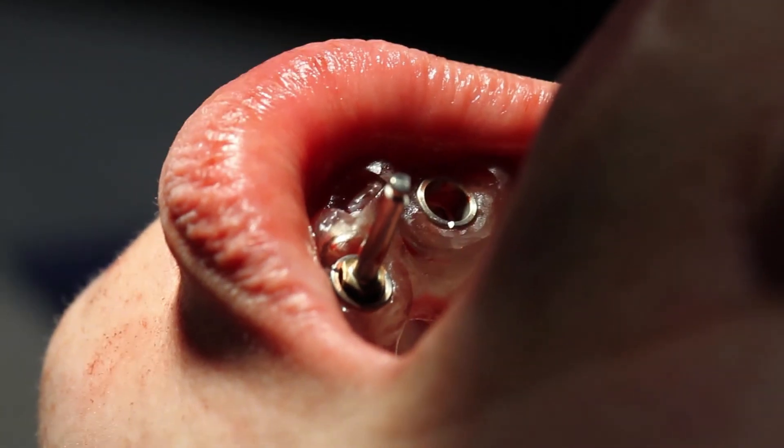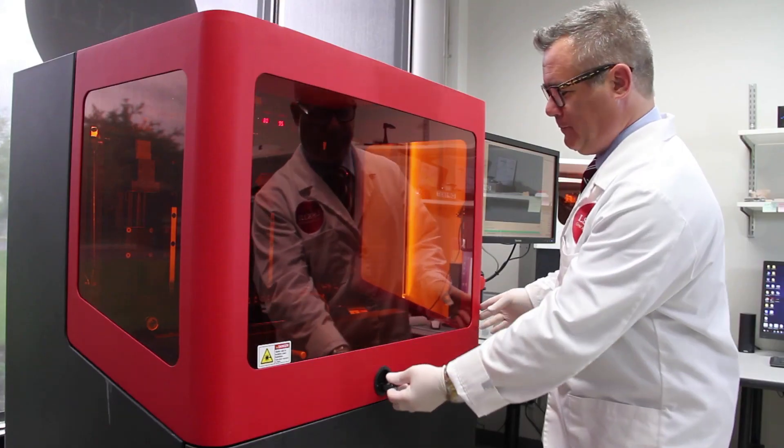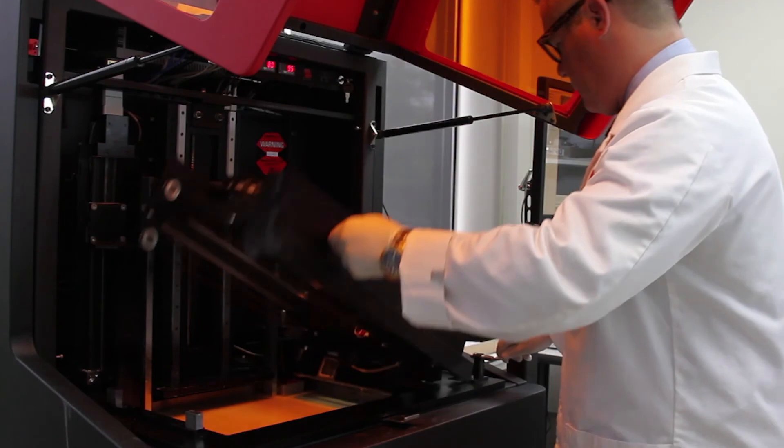More cases can be done. More patients can be helped. We do print a lot of models here. After designing the models, we use our Vector to print them.